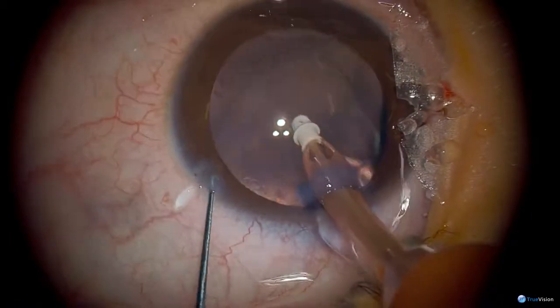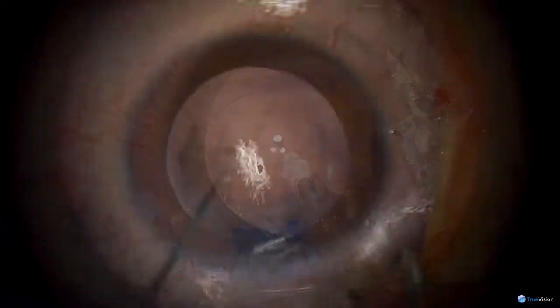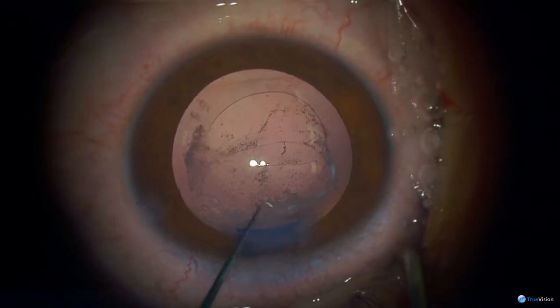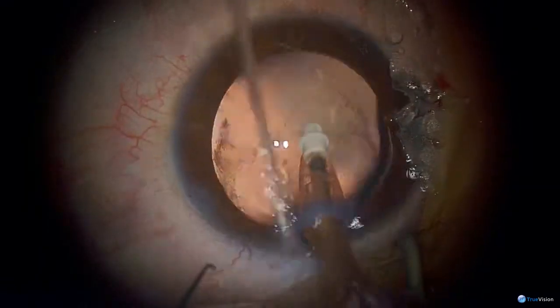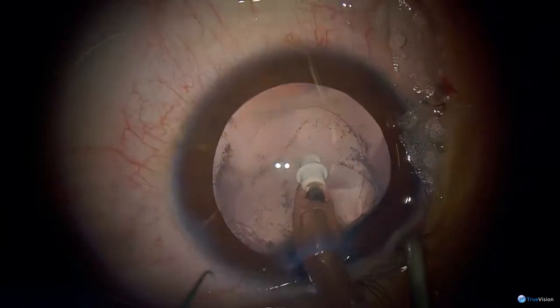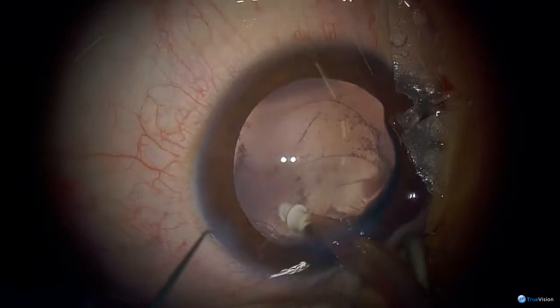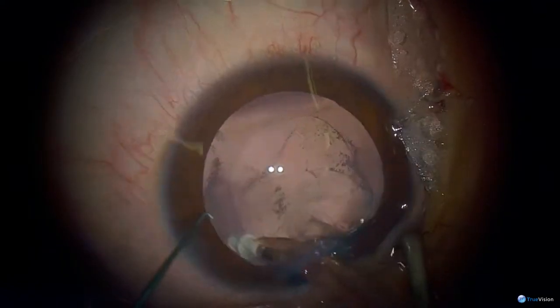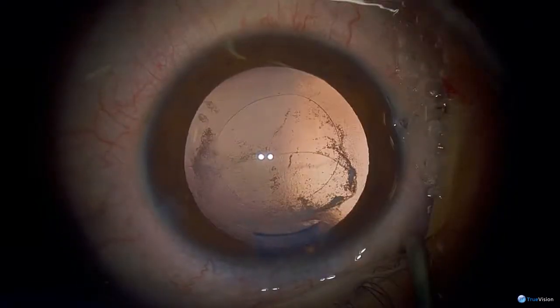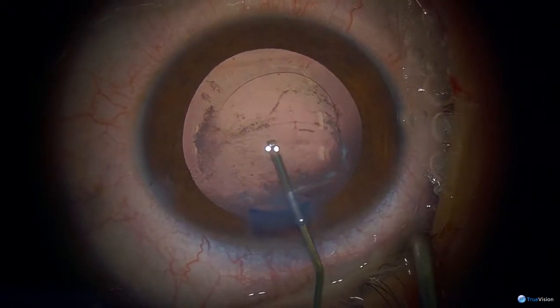There's a question from the classroom wondering about the membrane — are you going to leave it or take it out? I think that line there is a tear in the posterior capsule. This is posterior capsule here, and underneath is probably the anterior hyaloid face of the vitreous — that explains why he's got a cataract. So I'm going to put a lens into the bag. He's already got a hole in the posterior capsule, which is what I was going to do anyway — a primary posterior rhexis. Once the lens is in, I'll just try and extend that hole behind the lens.